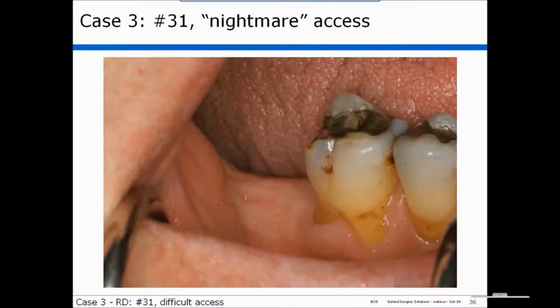The first question that came in is regarding the scanning protocol for the model. If you could elaborate on that a bit. Yeah. What we do is we cone beam scan plaster models, and that gives us tremendous flexibility in what we do. And that's how we get the models. So when people send us models, they're cone beam scanned and then merged in with the Blue Sky Plan anatomy of the patient with the bone scan.